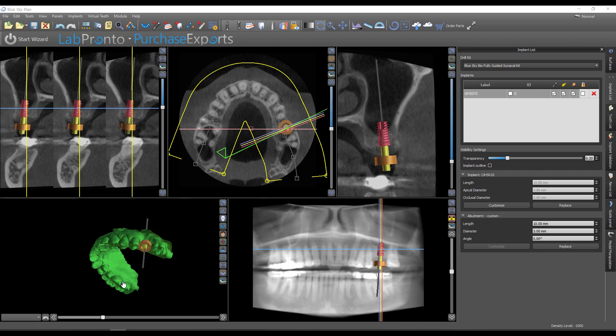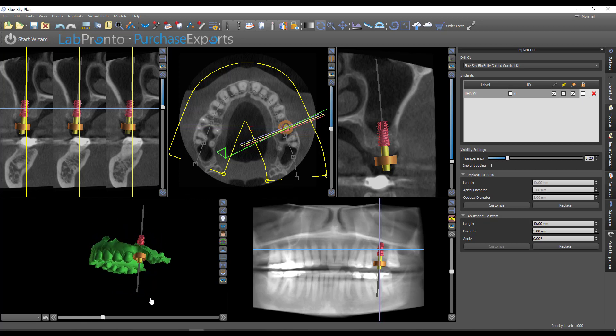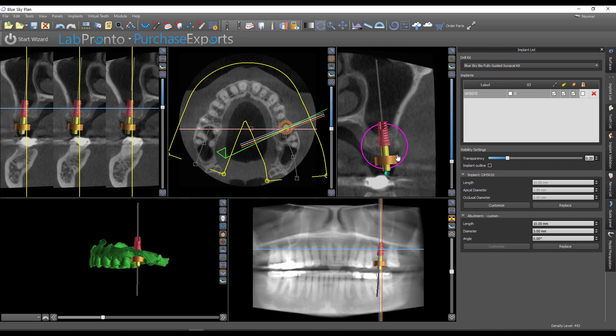But real quickly before I do that, this was a case that someone sent to me recently. They had just purchased the fully guided crestal sinus lift kit that BlueSky offers. It's a guided sinus lift kit, and I thought this was kind of interesting and worth showing because this was the first sinus lift he had ever done with this kit, and I thought it was a really impressive result.